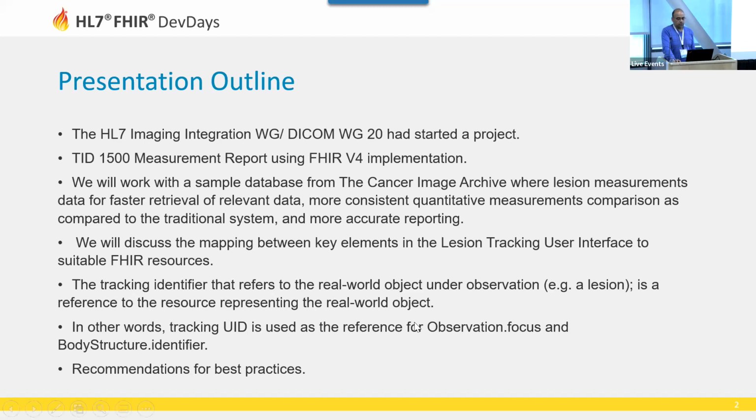So we will use the focus field of the observation resource to refer to the body structure identifier in that sense.